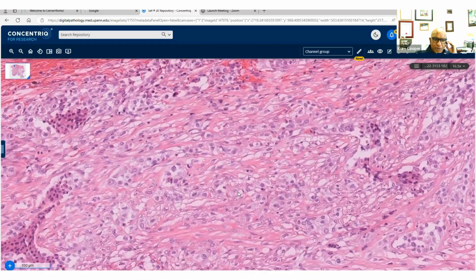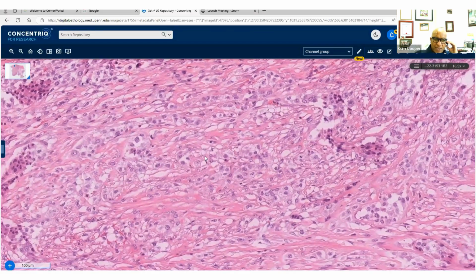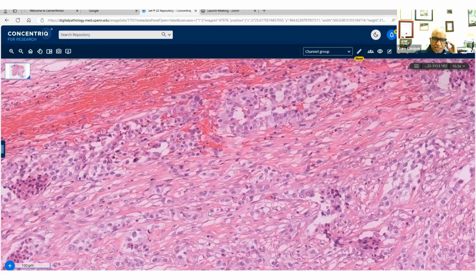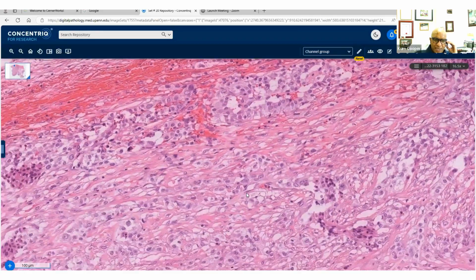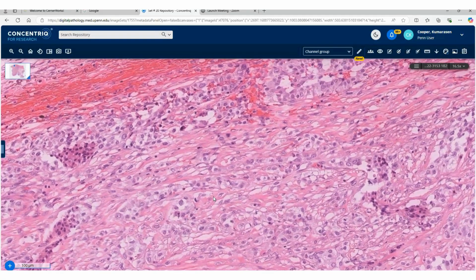And then thirdly, of course, in context, if we're thinking about mesothelioma, or if we're thinking mesenchymal, I would then embark on a set of immunohistochemical panels for those possibilities. In this context, I do not think anybody's thinking lymphoma, so I can take it that we will not be doing any lymphoma markers. Koom, yes. Sorry, Koom, we've got some comments. Good.